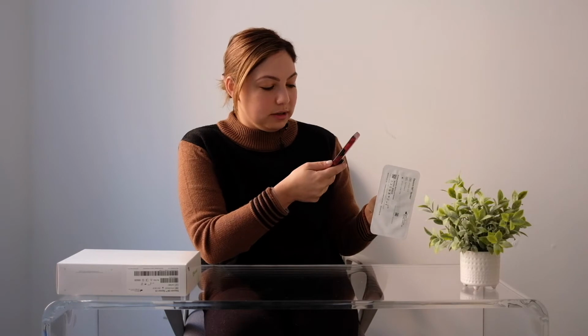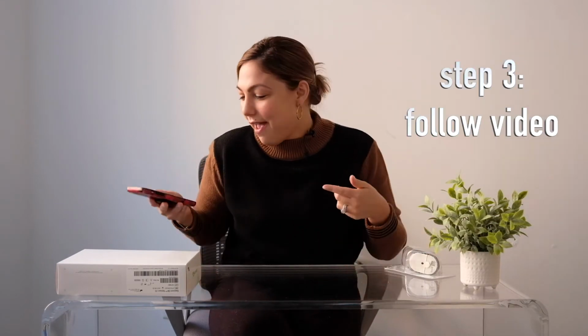You can either enter your code that is on the front here, either enter it manually, or I like to use the picture. It gives you a nice little success arrow, always fun. Then, even though we've done this 500 times, you always get the lovely little video where it tells you how to do it. I like to use my stomach.